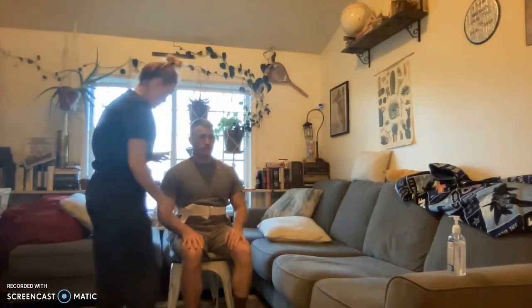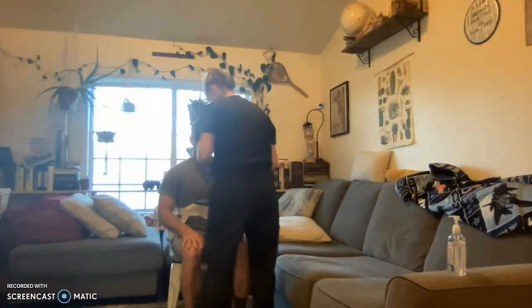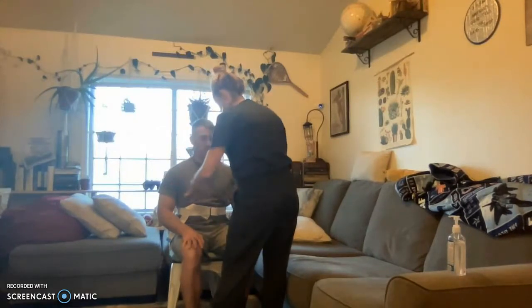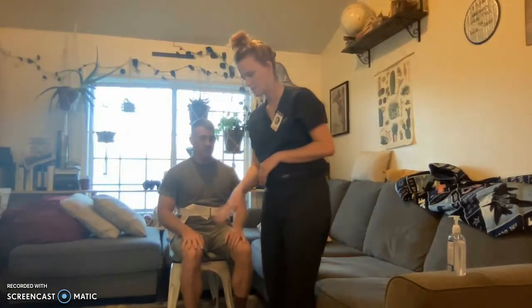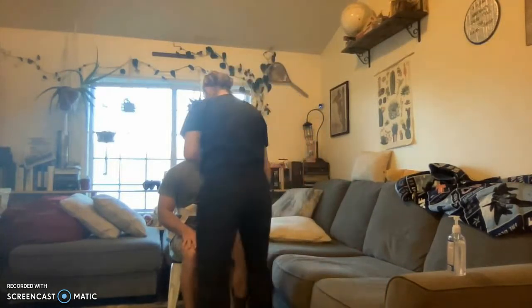All right. For this, what I'm going to do is come right in front of you like this to brace your knees. Then I'll hold your gait belt here — one hand at the front, one hand at the back. You're going to rock three times as I count to three, and then the third time slowly stand. Then you're going to take about three or four steps around here, turn around and come right back. Okay? All right. You ready?